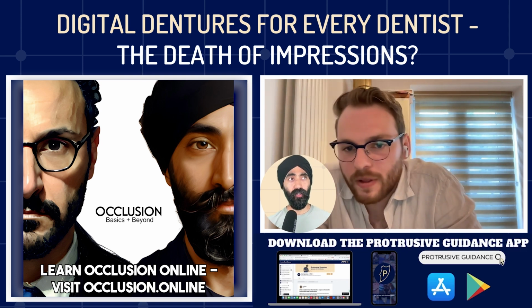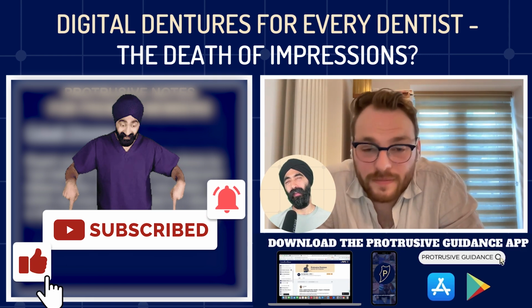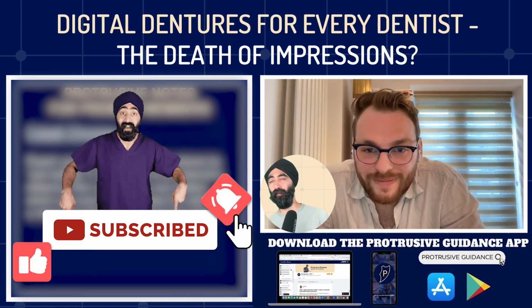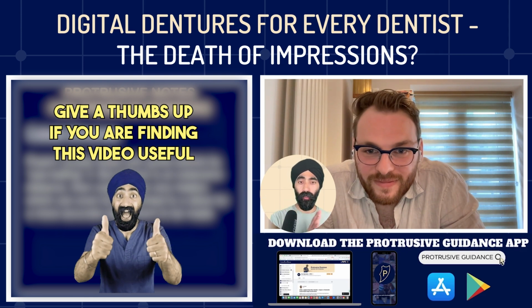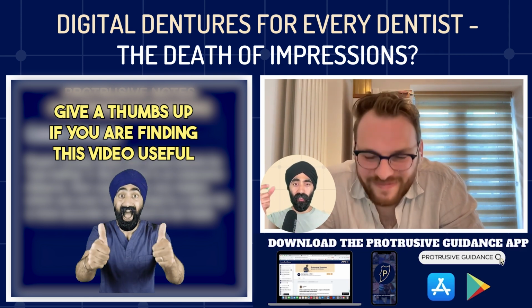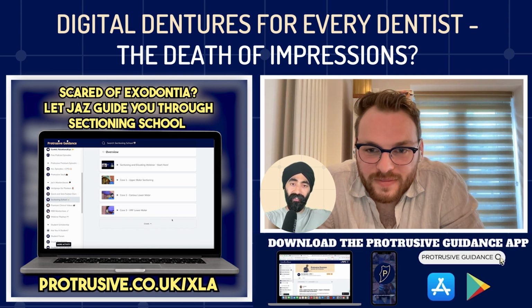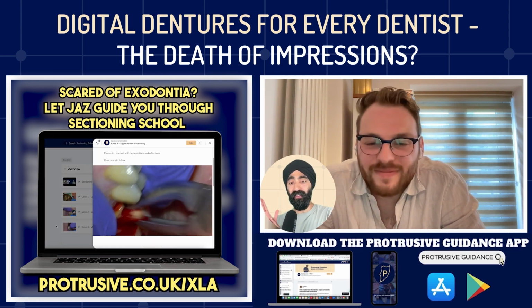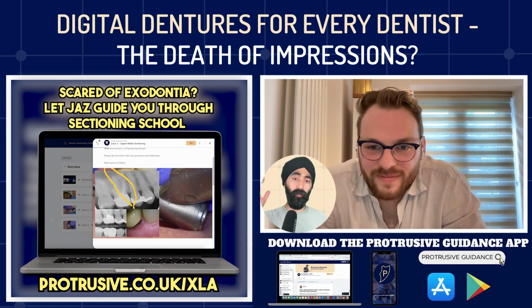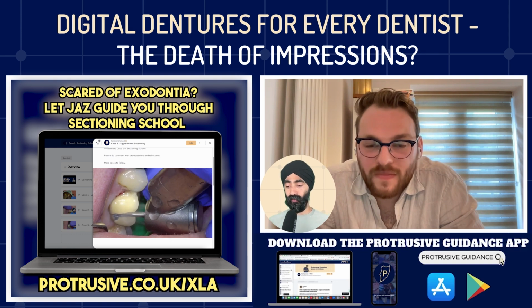And it's great to use, and also in the fixed prosthodontic world, where I remember doing this crown, and then the contact with the future implant wasn't going to be very good, and so he wanted me to prep the mesial some more. So he sent me this digitally printed coping, put it on, and just for the few seconds precisely managed to remove that piece of tooth structure to allow the crown to fit, and then now had a better contact area for the future implant. So it's great, and to be able to do this so efficiently is absolutely fantastic. So I'm glad we touched on that.